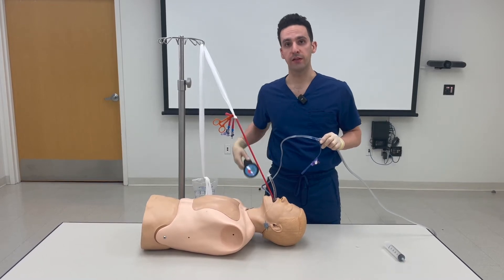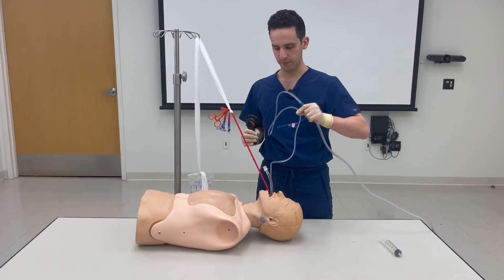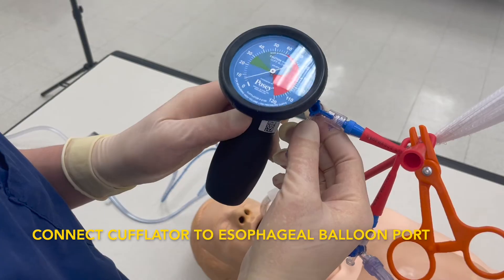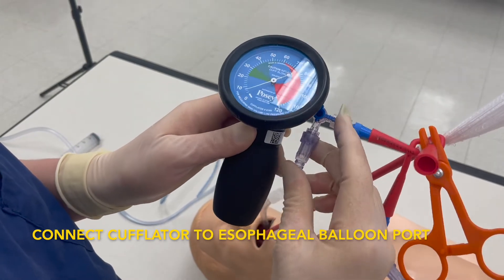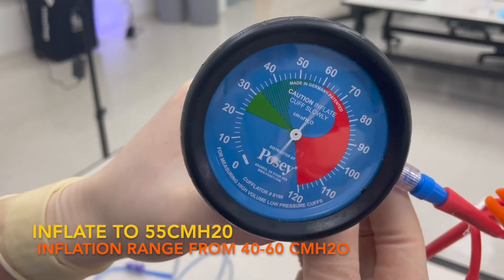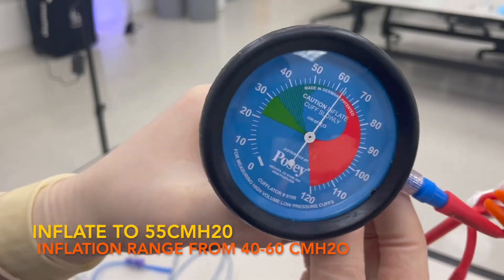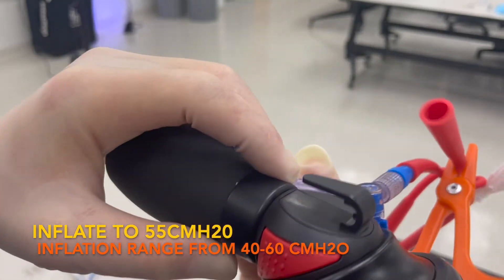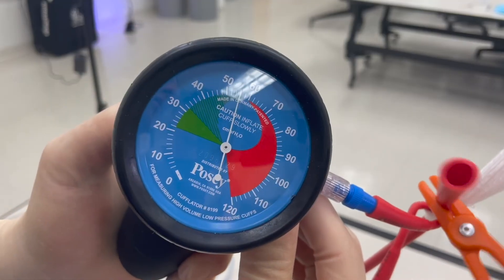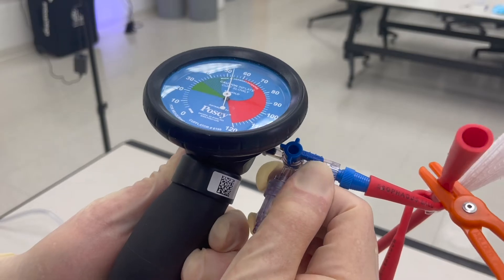Remove the gastric tube. Connect the cufflator to the three-way stopcock that's on the esophageal balloon. Ensure inline airflow and inflate to 55 centimeters of water — that's equivalent to approximately 40 millimeters of mercury. If you over-inflate, use the red valve on the side to release some air. Secure the position of the three-way stopcock valve towards the Blakemore.